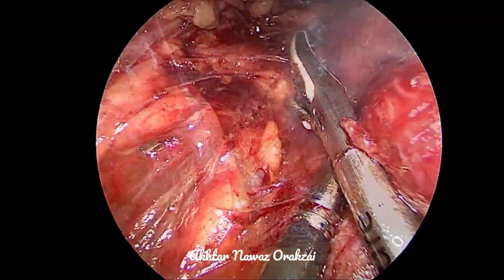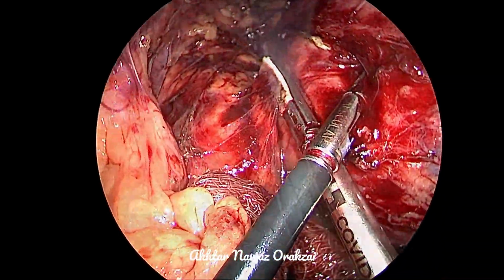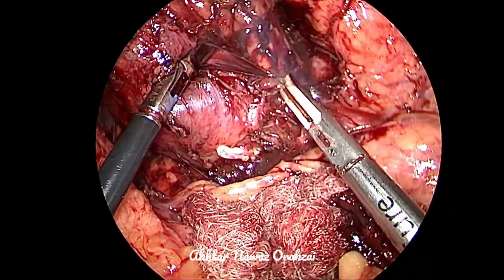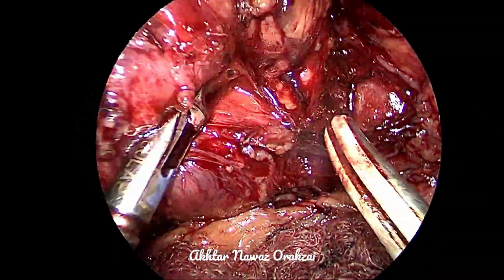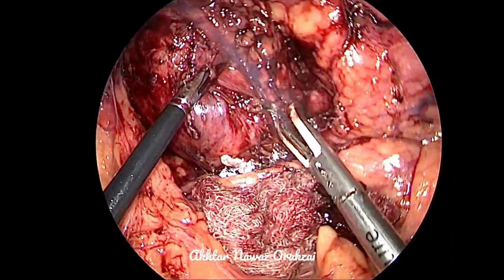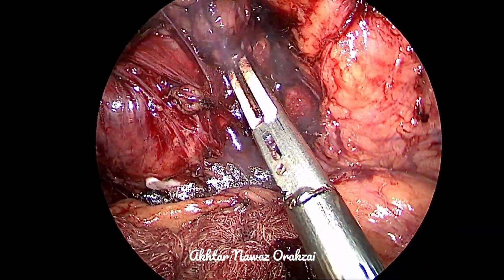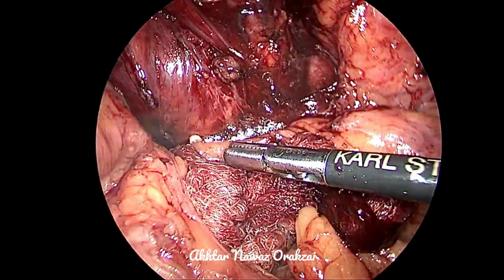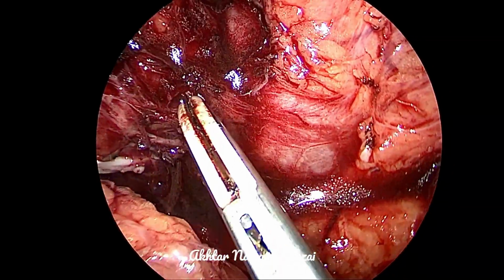The inferior phrenic artery gives a branch to the adrenal gland. Then there may be direct branches from the abdominal aorta, and there are branches from the renal artery. So our aim now is to mobilize the adrenal gland enough to expose the arterial supply of the adrenal gland, so that those vessels can be clipped and divided, and thus adrenalectomy performed.